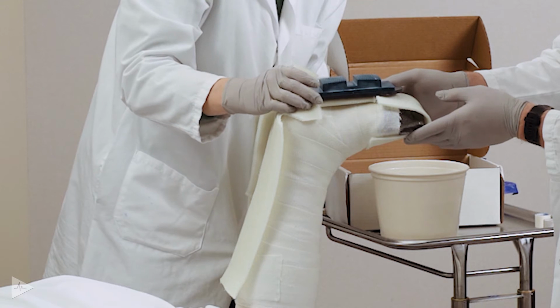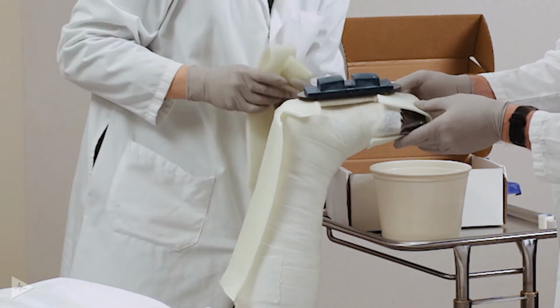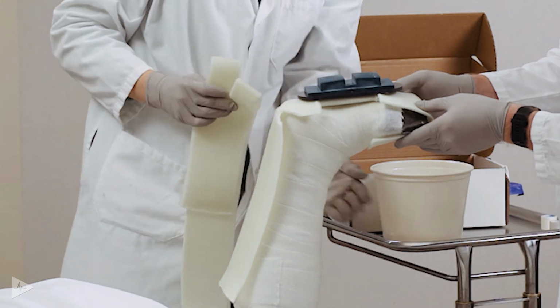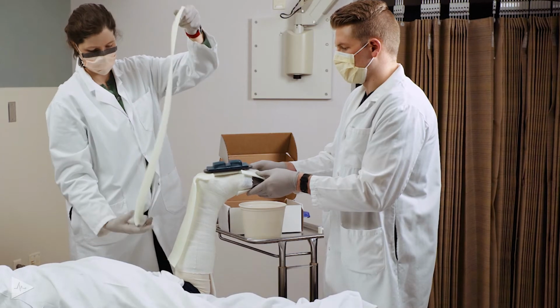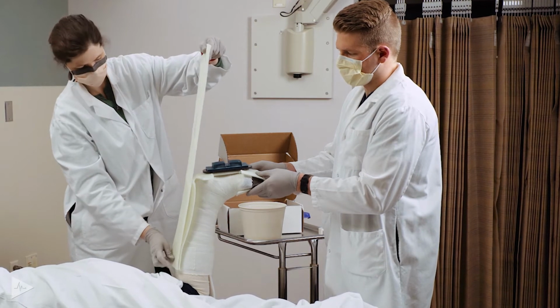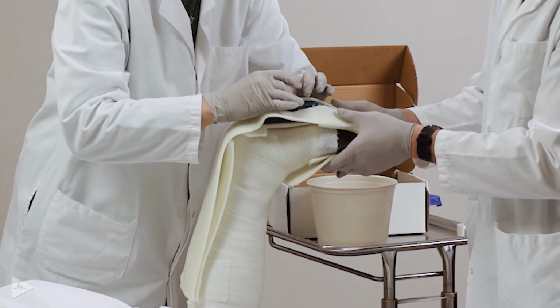And so for this patient, we'll move that just slightly back here. So the midline here is coming down to line up with the tibial crest. Then we will apply the second splint, again aligning with what will be the top of the cast, bringing that over. We want to widen that around the peg.